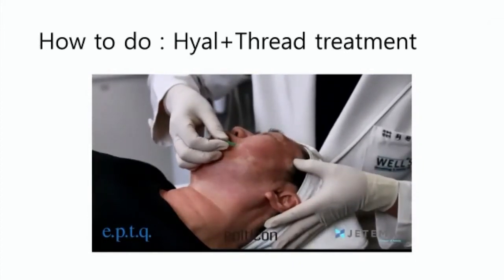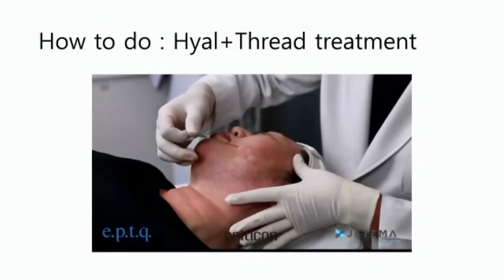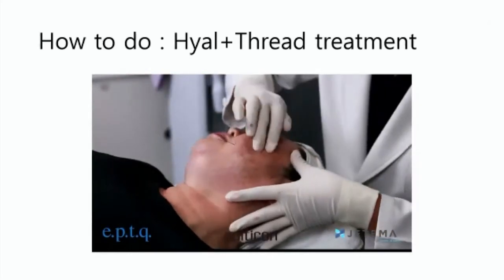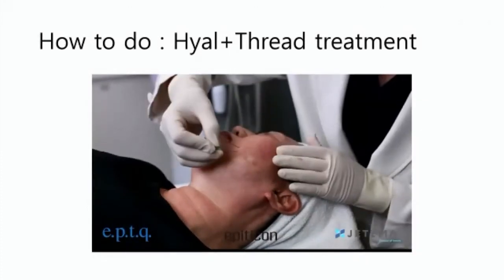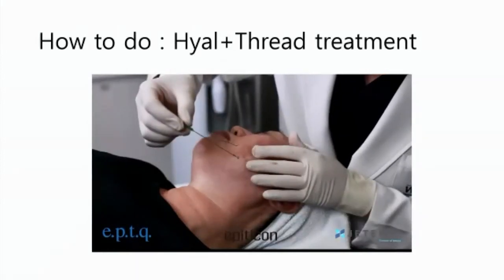When you reach the hairline, you can touch the tip of the PDO thread and pull out the cannula. And then massage to fix the thread inside the tissues.